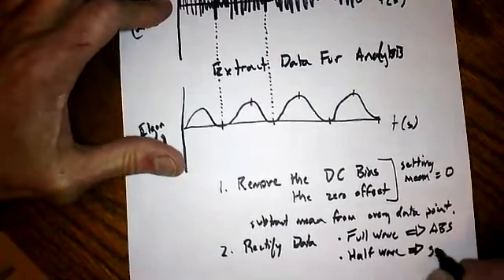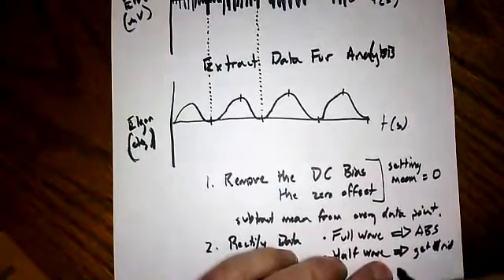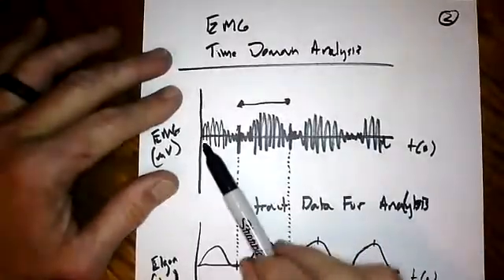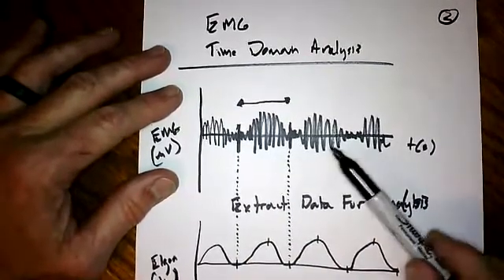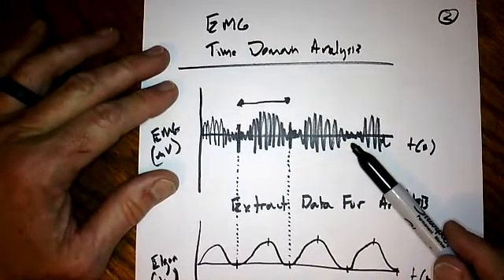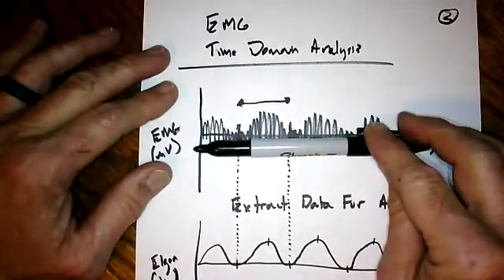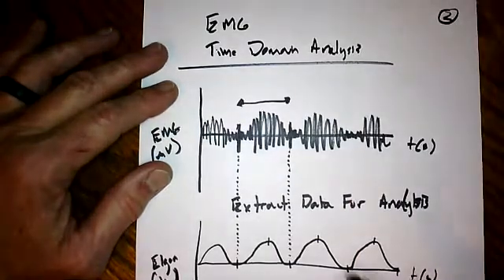And that gets rid of anything less than zero. So any negative data, okay? In essence, what you do is just wipe out anything below zero. I typically don't do that. That would have been a common way if you're having some computer processing issues and you want to minimize the data that you're working with. That was an acceptable way, just to take away anything less than zero.